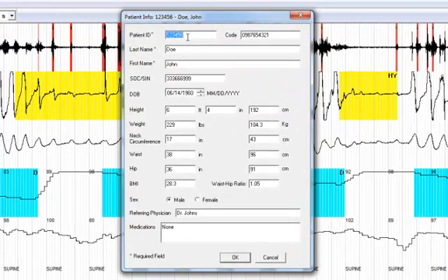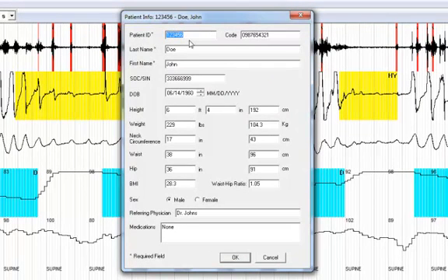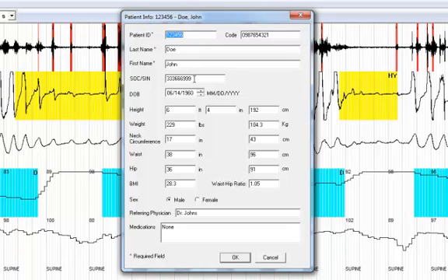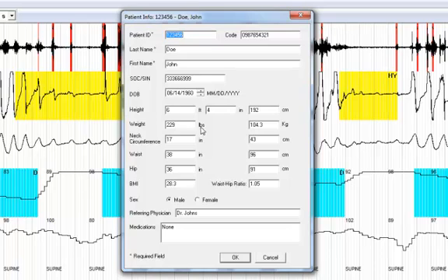This dialog box contains the biographical information of the patient including patient ID, code, last name, first name, social assurance or social security number, date of birth, height in both imperial and metric measurements, weight in imperial and metric measurements.